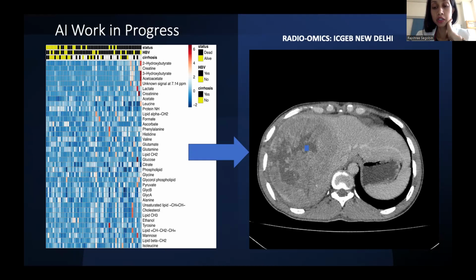If I'm not mistaken, you can't use LI-RADS when the cause of the liver disease is a vascular problem such as Budd-Chiari. But when you have a portal vein thrombosis due to tumor, that's not actually the cause of the underlying liver disease. No. Okay, I think it's cirrhosis. If the liver is cirrhotic from Budd-Chiari, then you cannot use LI-RADS. But if there is thrombosis as a consequence of the tumor, then you can use tumor in vein.